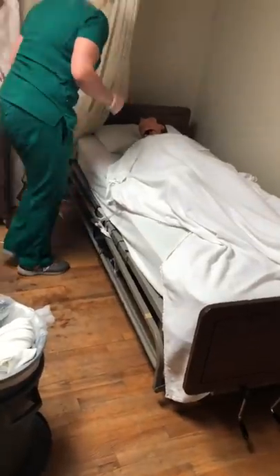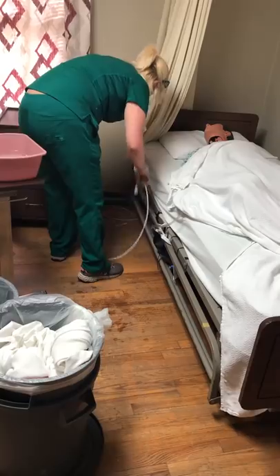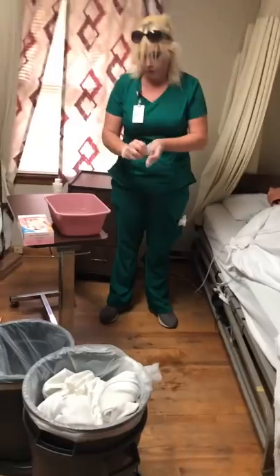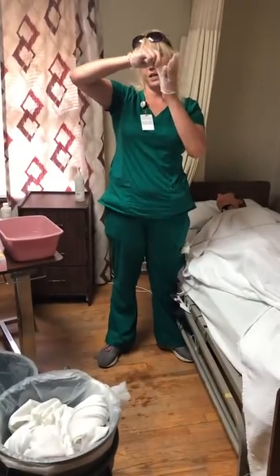Open the privacy curtain. 'Is there anything else that you need?' 'No.' 'Okay, let me give you your call light.'